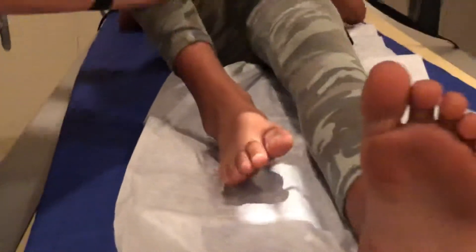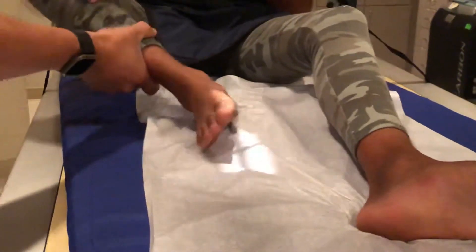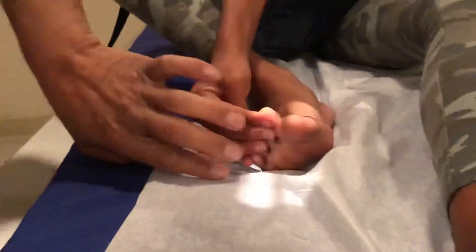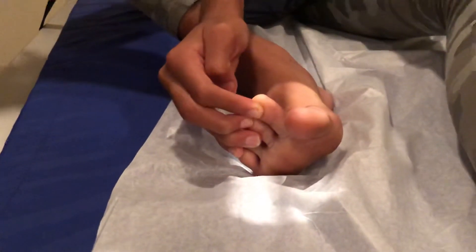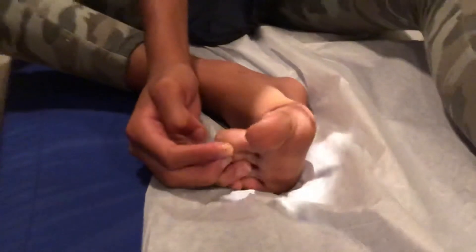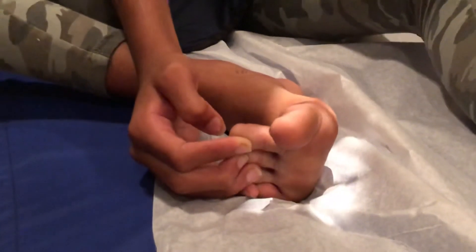So I'm gonna have you sit up — you're gonna help me position for this. We're gonna take your knee and put it down towards the table. With this hand, I want you very carefully to pull out these other four toes as far back as they go. Pull real far, grab them at the very tip. There you go. Bring your toe down now more. Good, right there. Now if you cone well enough here, the only thing you might be getting would be the little tips of the fingers here. So if you cone down well enough, you should be okay. Shoot the x-ray and we're done.